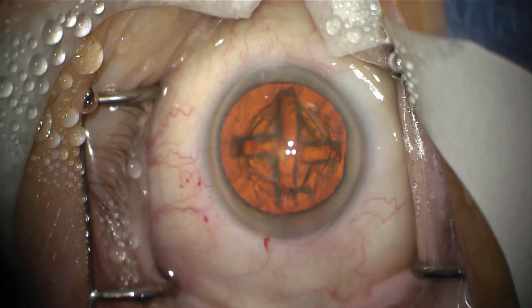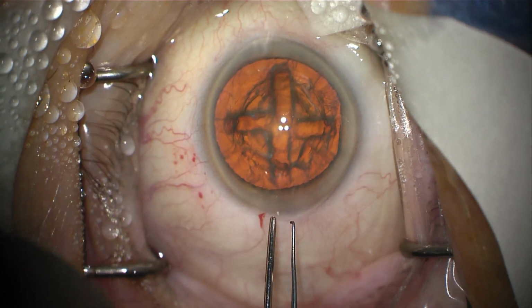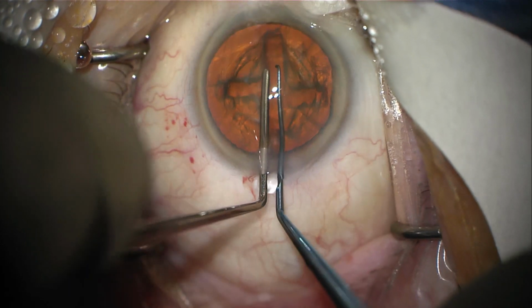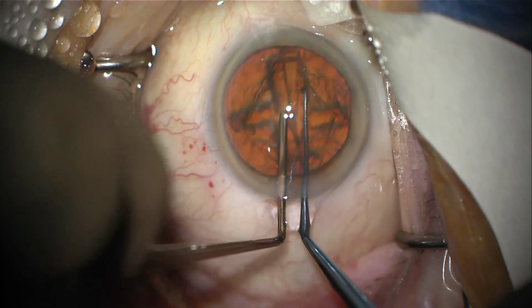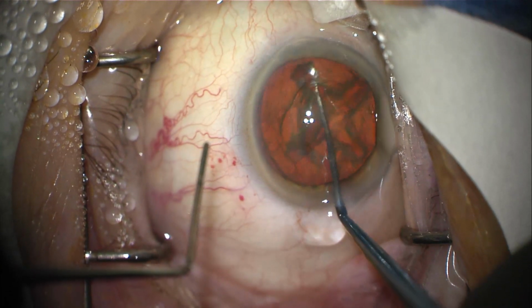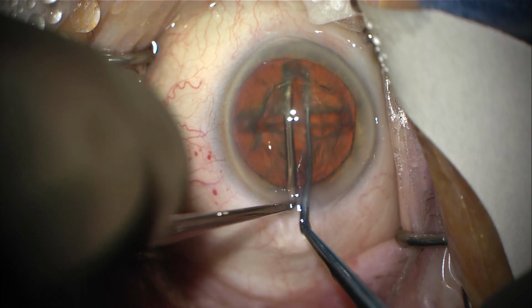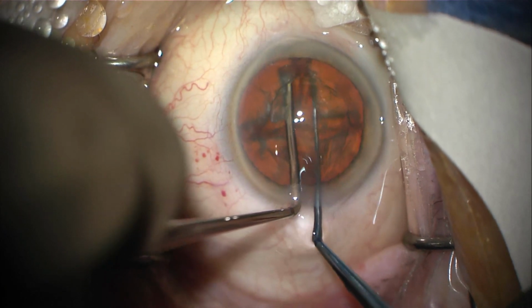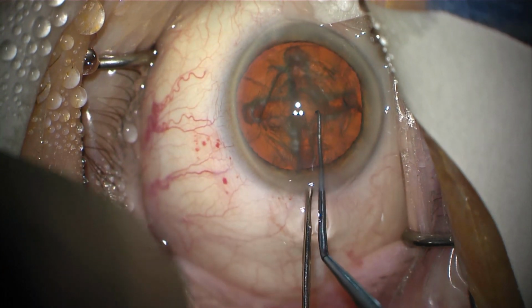Now I can't get out the whole cataract, which is about 12 millimeters wide, through a 6 millimeter incision that I made in the capsule. So what I'm going to do is crack or split the cataract into approximately 4 equal pieces using these two devices. One is called a Cykiert hook. The other one is called a cyclodialysis spatula. I rotate the lens at 90-degree increments.